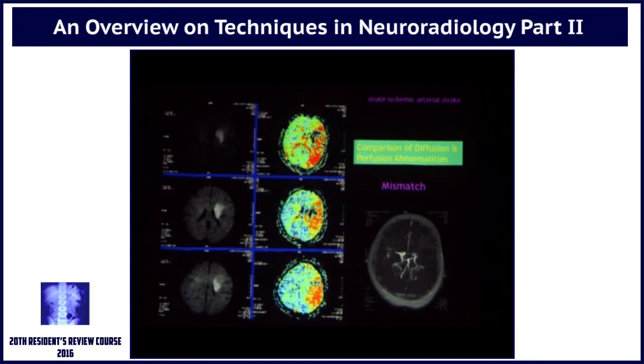If a patient has a penumbra, then the patient will benefit from a reperfusion therapy, and the extent of paralysis can be restricted. So, for example, in this patient who had acute right hemiparesis, who came to the casualty about 1.5 hours after an acute stroke, the diffusion weighted images in the first column show you the infarcted core. This is already dead tissue.